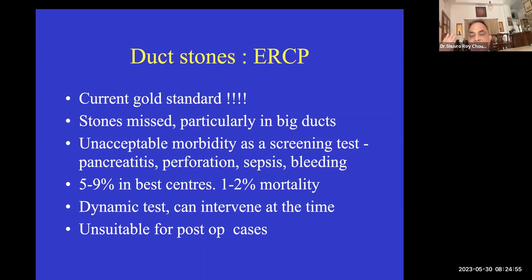So when you are doing a barium test, or a fluoroscopy test, anything, whether it is coronary angiography, a barium enema, a small bowel contrast enterography, or an ERCP, whatever is a fluoroscopic test where you are looking at the X-ray screen and you've got a planar, 2D view.